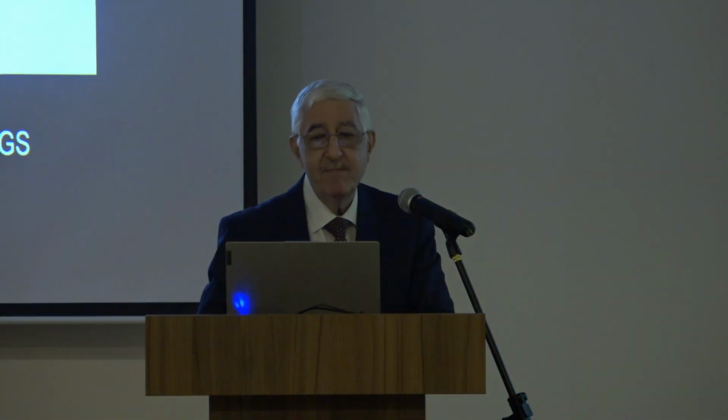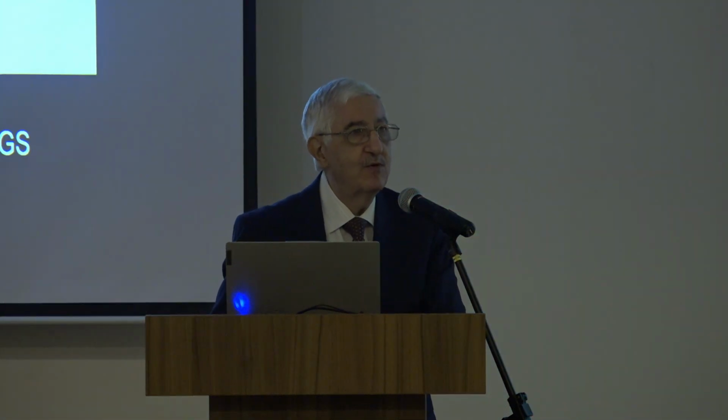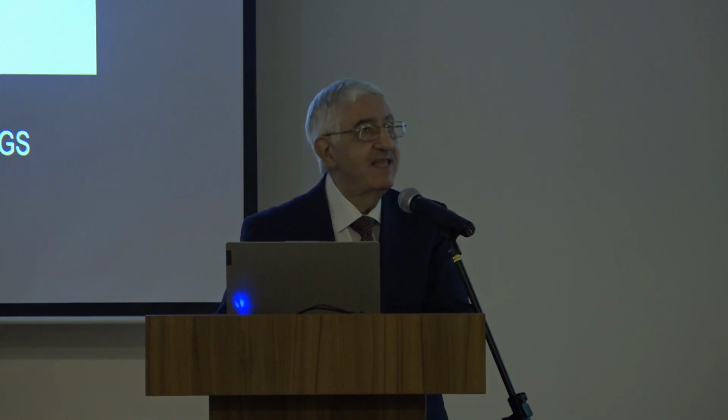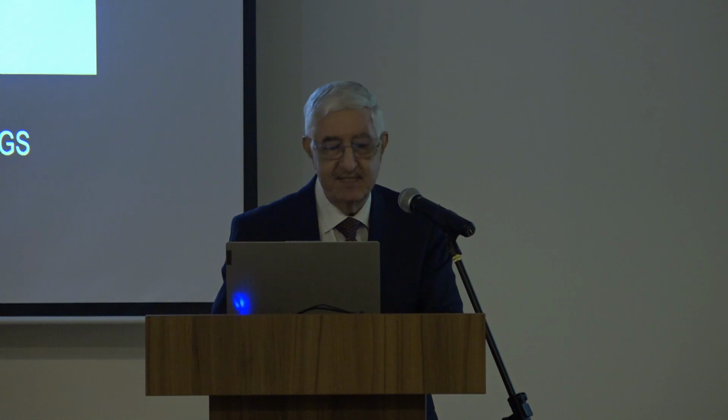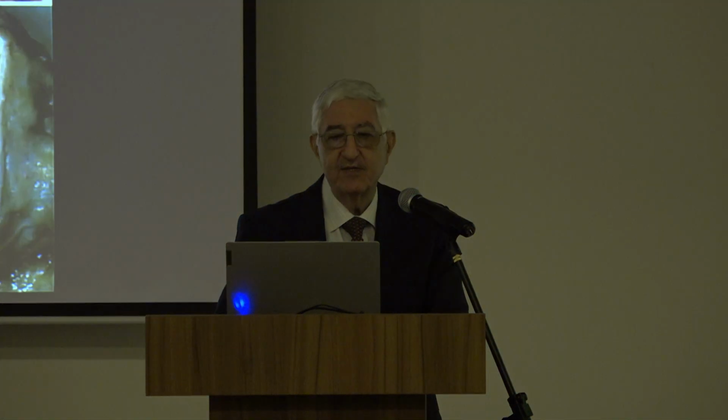Now, I'm going to talk about aortic stenosis beyond gradients. Since the drawings of Leonardo da Vinci in 1512, there have been tremendous achievements in the diagnosis and treatment of aortic stenosis.